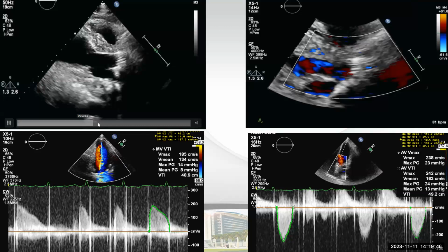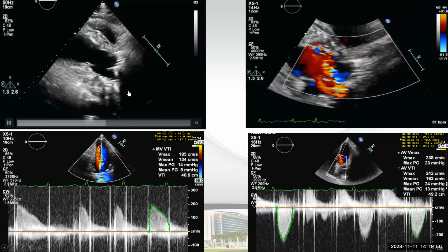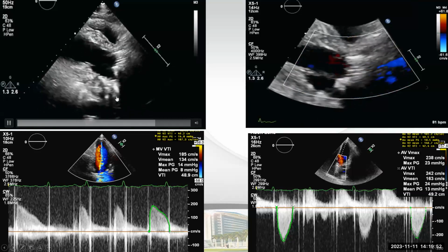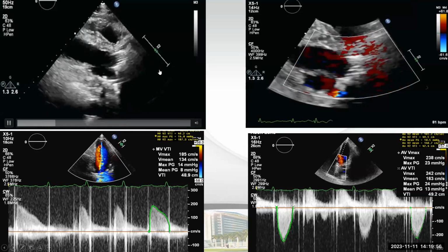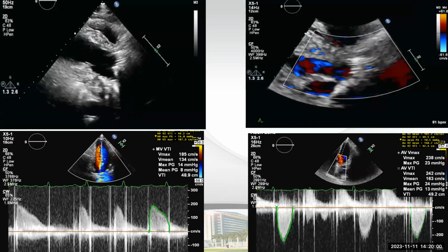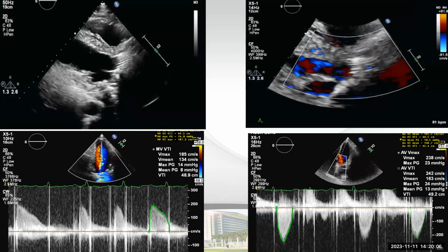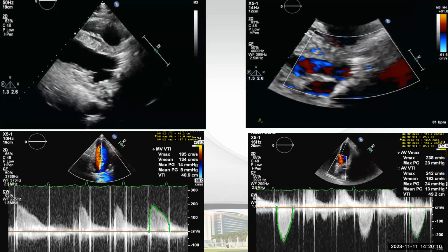Okay, so likely this is the answer. You know, this is a mechanical mitral valve, very clear. As I said, you have a lot of mechanical shadows, so you must not miss the mechanical aortic valve. Definitely in any echo exam or any cardiology board exam, even in the F1 and F2, he will bring for you a mechanical valve, either mitral or aortic, with some scenario. So you have to expect at least 20 questions with mechanical valves.